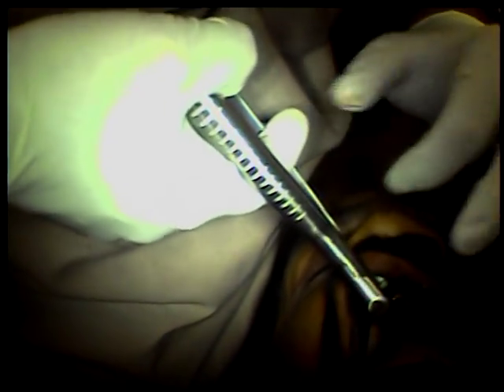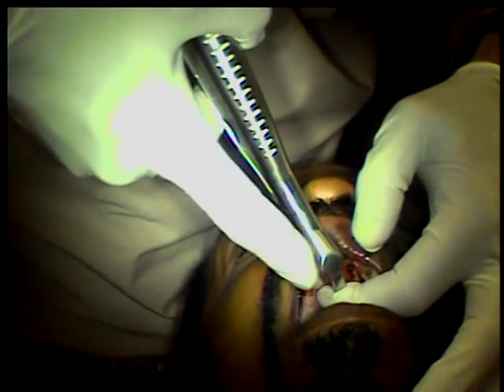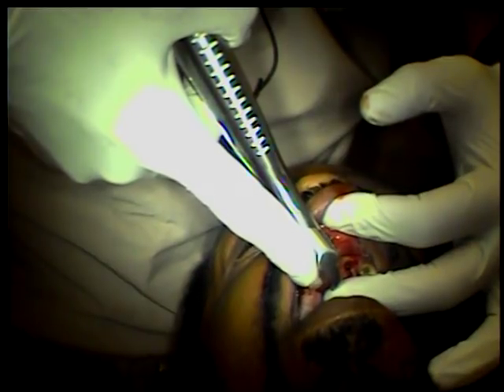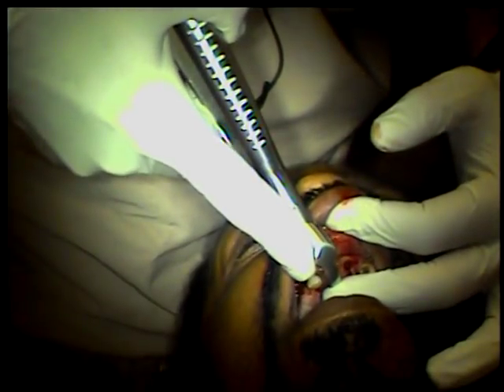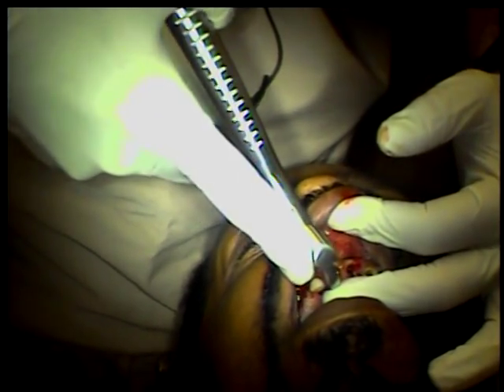Let's do this one. Again, two fingers. Wrist controlled. Waiting for the energy to build up. The tooth is down.